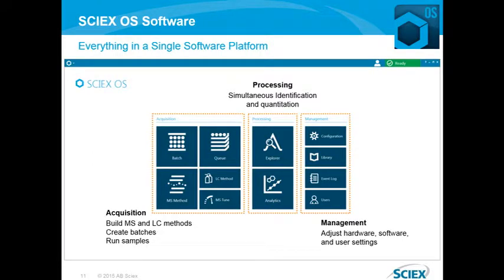The software homepage contains a module on the left allowing the creation and implementation of analysis. At the center are the tools for qualitative and quantitative reprocessing. And finally, on the right, the configuration module for the software parameters.